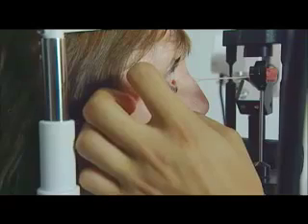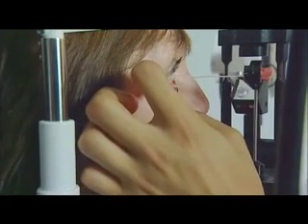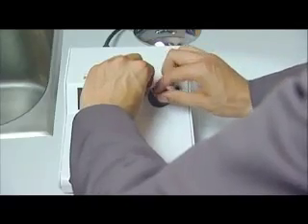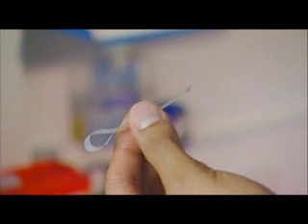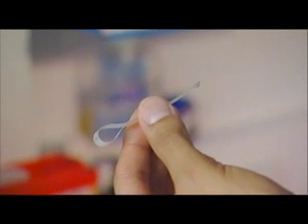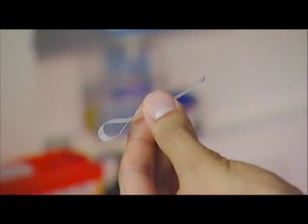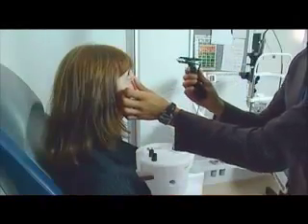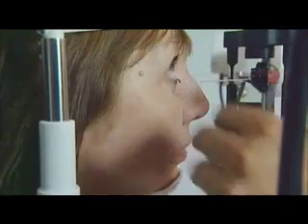In meibometry, lipid on the lower central lid margin is blotted onto a loop of plastic tape, and the increase in light transmission measured by optical densitometry in the meibometer is proportional to the amount of lipid taken up onto the tape. Loops of plastic tape obtained from Courage and Kazaka are prepared with the rough absorbent side outwards and mounted in an applicator, or within the prism housing of an applanation tonometer.